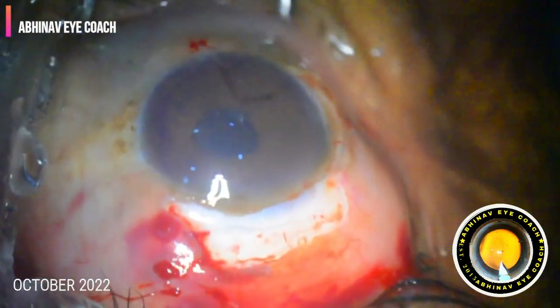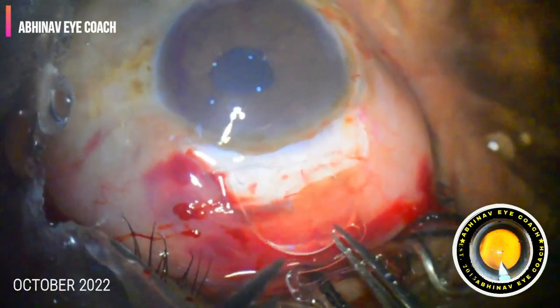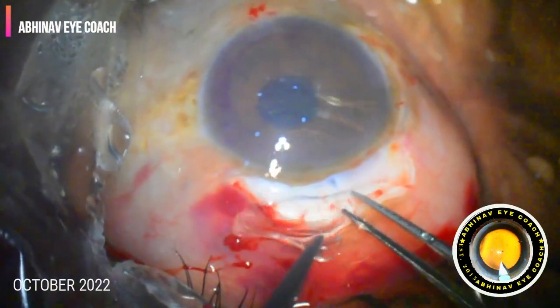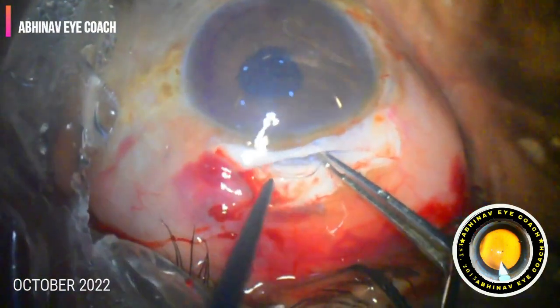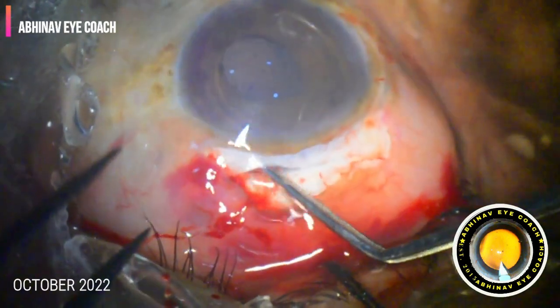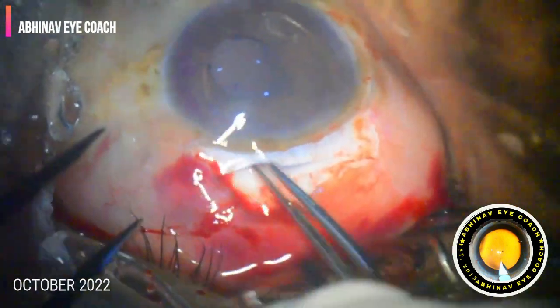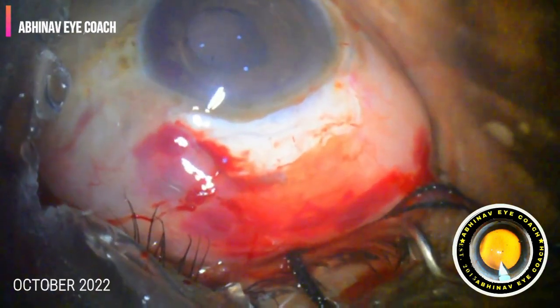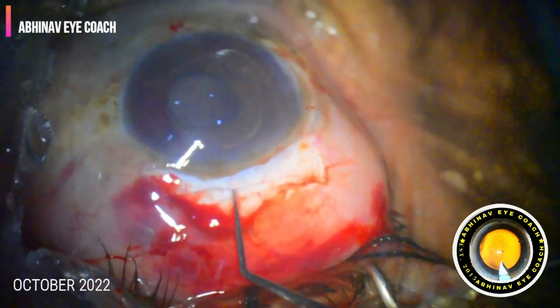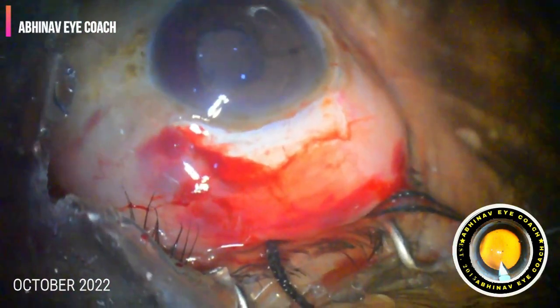In this case I will be able to implant an anterior chamber IOL; on a later date I will explant this and perform scleral fixation. For now I have planned the anterior chamber IOL. I introduced the AC IOL — first vertically, then rotated it horizontally. The haptics are placed into the angle, the pupil should be absolutely round, and it should overlap the optic of the IOL. We can see there is no vitreous in the anterior chamber.